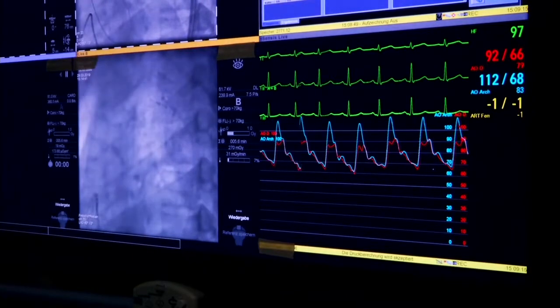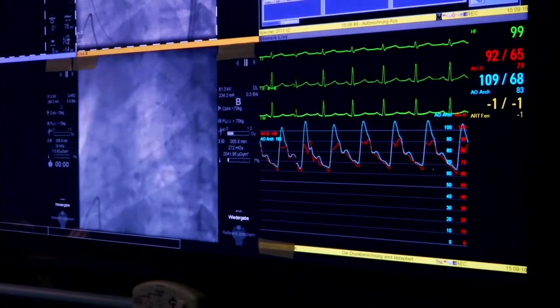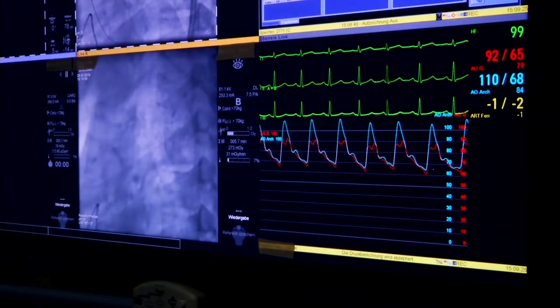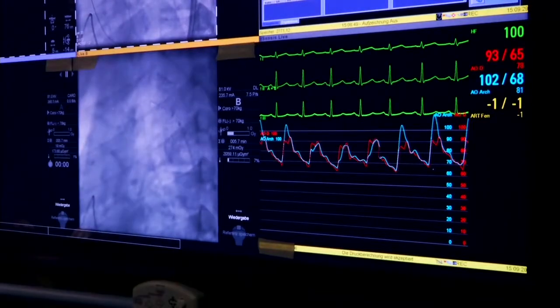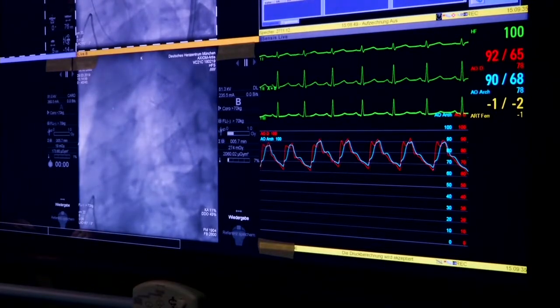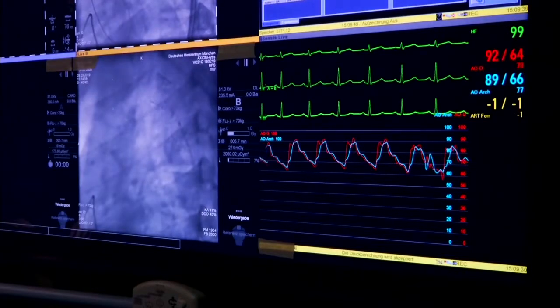This is here. Let's say here, okay. And I think there's almost no gradient. And now we go to the entrance of the first stent, and there's a gradient. You see that, guys? So it's clearly the upper part of this first stent where the gradient now occurs. Yeah, and that's predicted.